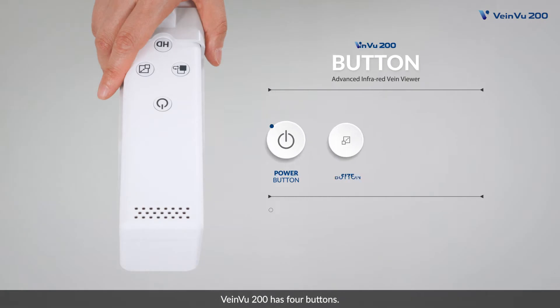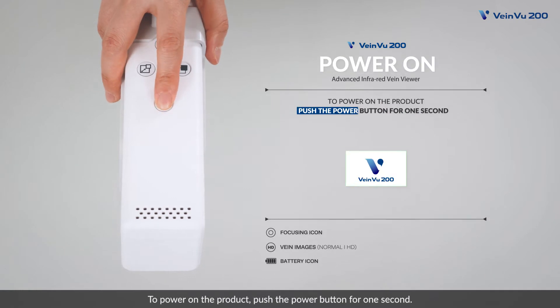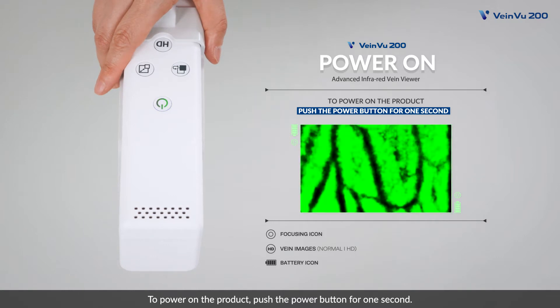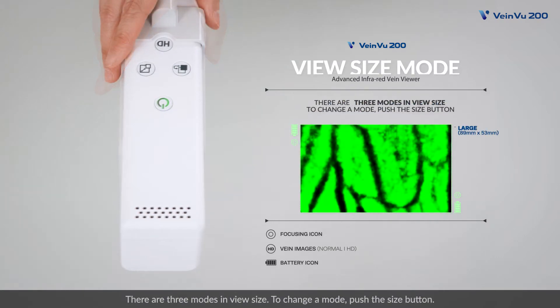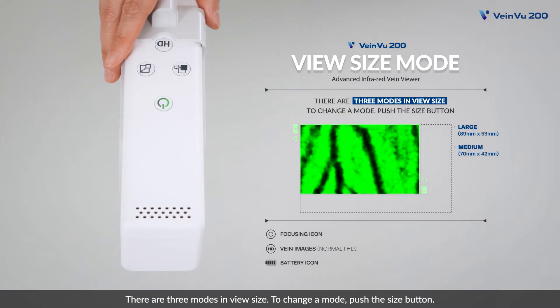VainView 200 has four buttons. To power on the product, push the power button for one second. There are three modes in view size. To change a mode, push the size button.